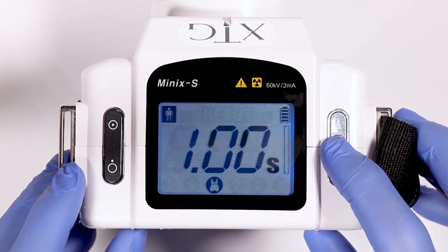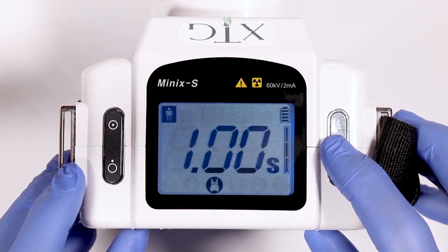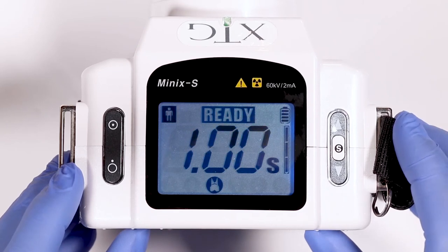Press and hold the S button, and it will save. When saved, notice again the ready sign will appear.